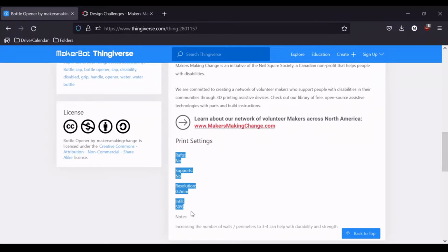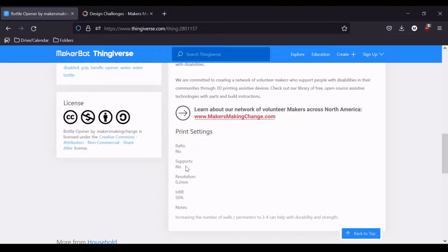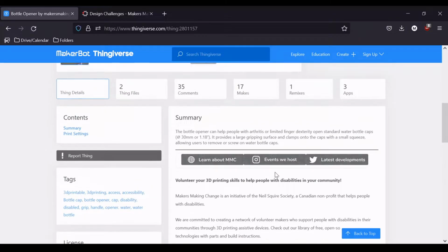So with the summary section right here, you can learn some about what's kind of going on with the print, some of the settings that they use. So you can see here they didn't use a raft, no supports, resolution was 0.2 millimeters, infill is 50%. These are all things that we can adjust in our slicer when we are actually printing the object.